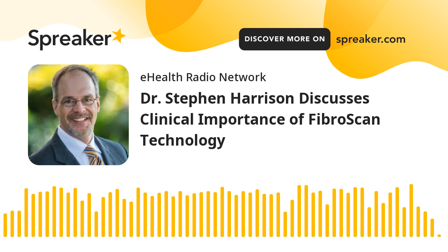And the hope there is that you're going to come back to me in about 6 months, and I'm going to repeat that FibroScan. And now I'm going to hope that the CAP score, the controlled attenuation parameter score, is dropped below 280. And now I can tell you, good news, a great joy, for today in whatever city you live in, you no longer have fatty liver.